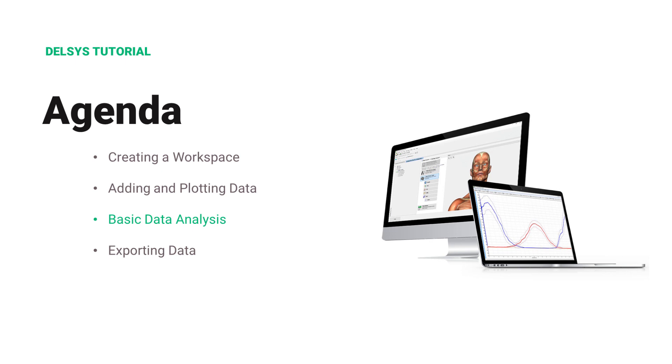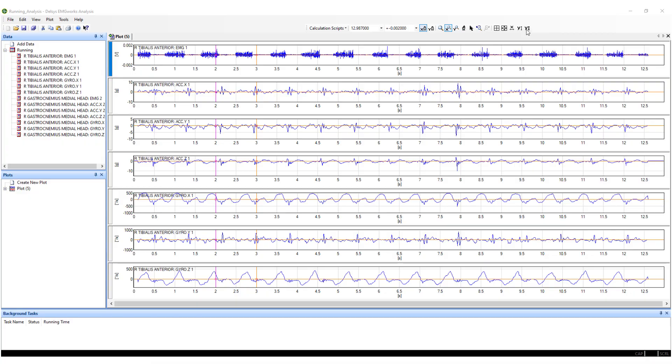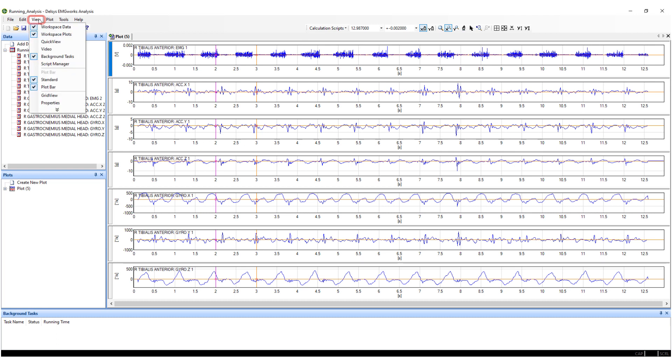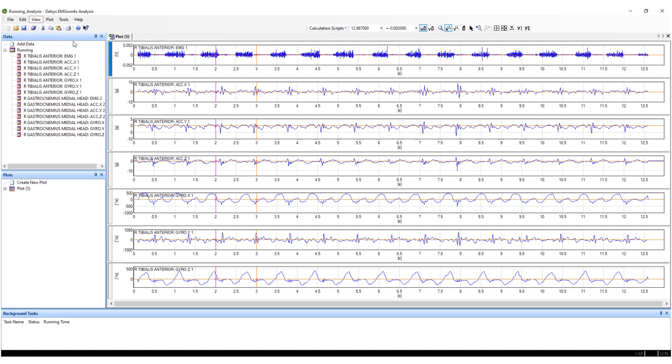With your data plotted, you can now perform some basic analysis. EMG Works Analysis offers a wide range of powerful analysis options, but also a simple and quick analysis toolbar called Quick View. To open the Quick View toolbar, navigate to the View dropdown and select Quick View.